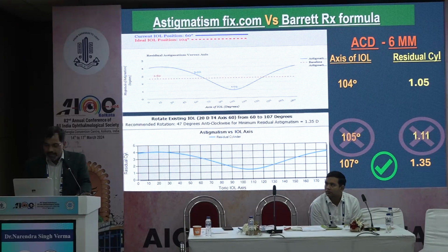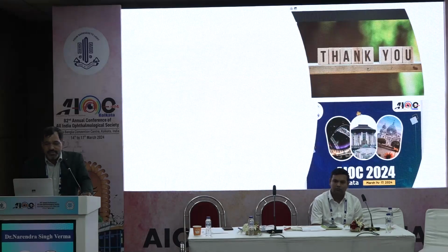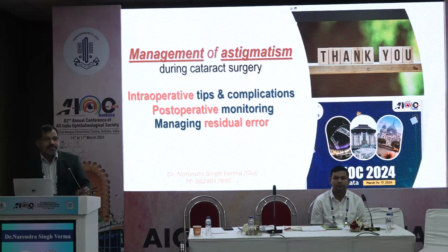So Barrett is anyway better than astigmatismfix.com, but data entry is easy in astigmatismfix.com because only 3 data are required to find the new axis of alignment. So that is easy to use, but it is better to do the Barrett RX. Thank you.